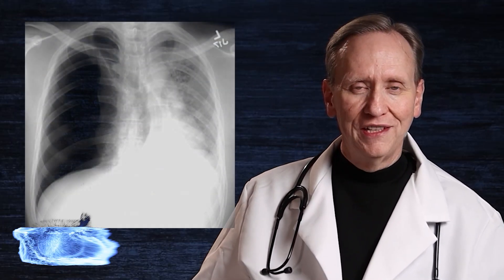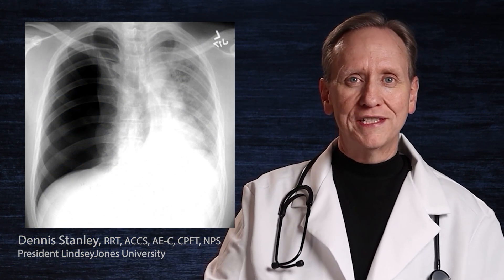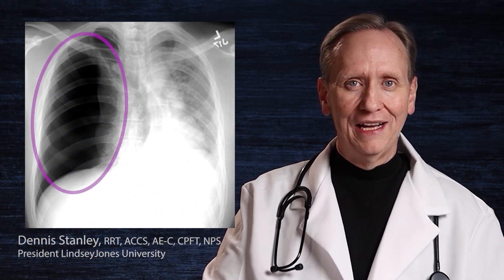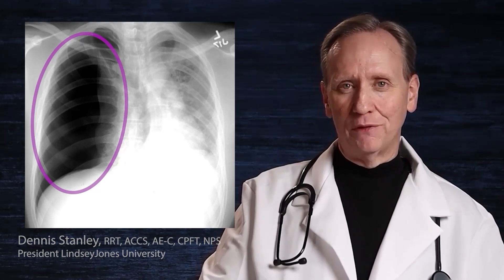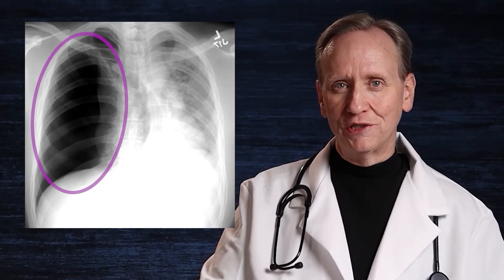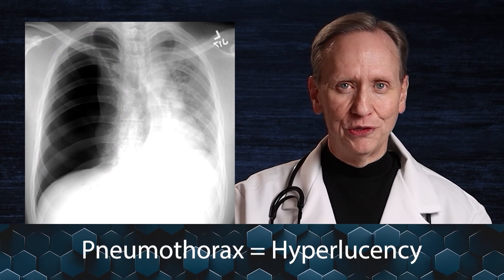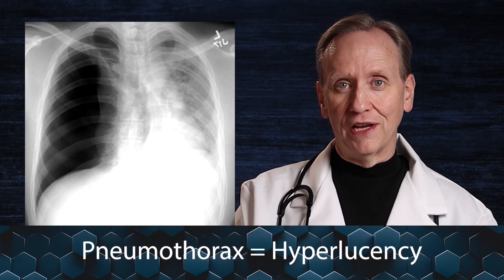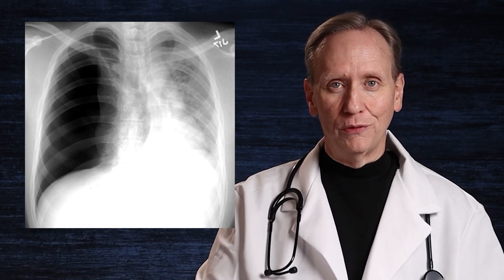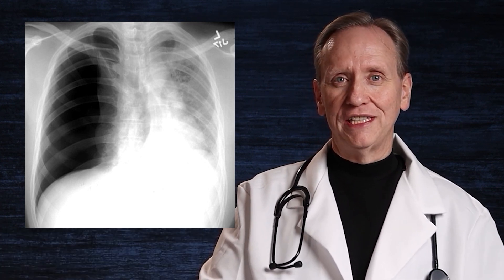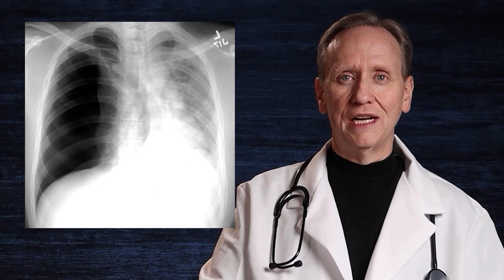Now let's take a look at certain pathologies and what their chest x-ray may look like. First, after talking about a normal lung, let's look at a pneumothorax. As you look at this closely, one side is a little bit more black. That black is described as hyperlucency — the x-ray is able to get through too much — compared to the normal side, which would be described as radiolucent.